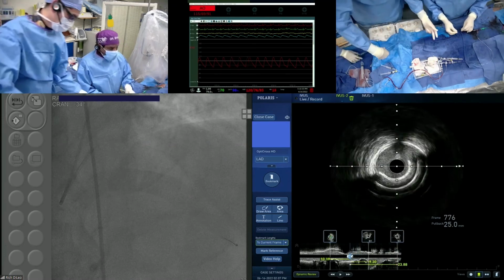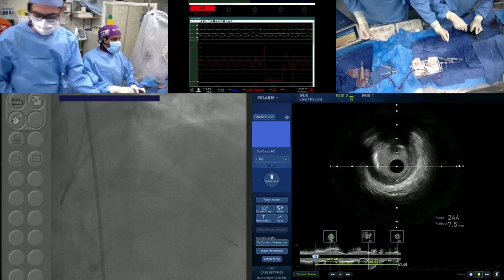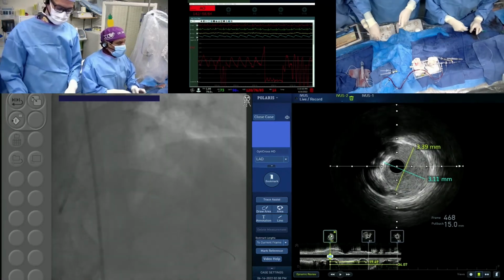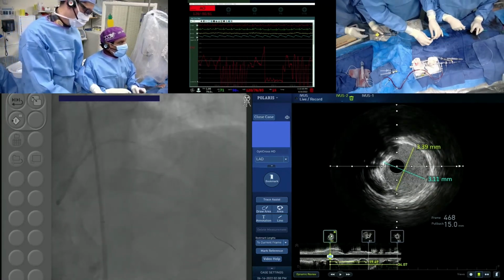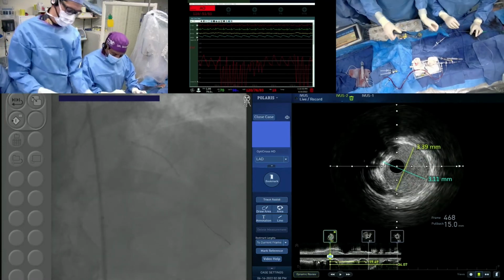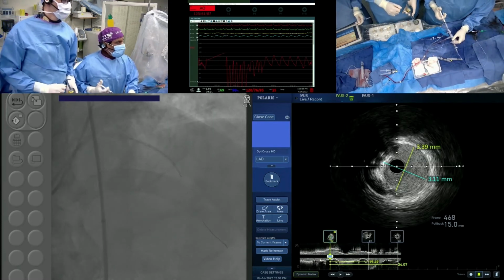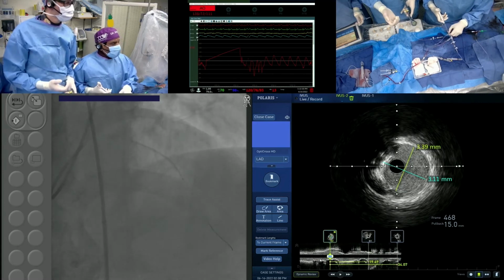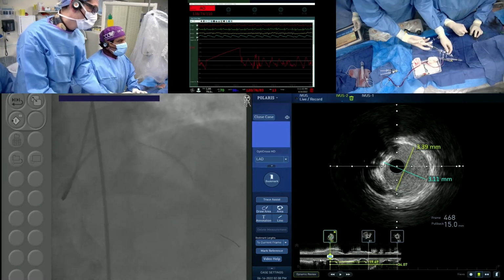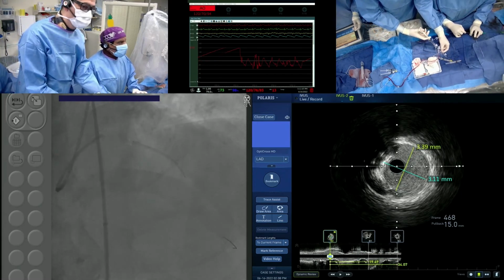Absolutely. You are absolutely correct. The question is at what point you bring IVL in this particular case. That's a very good point. I would say two things. If I had not done the imaging, or if imaging says the lumen is looking good, we have made some cuts, some interruption, it's okay, and it's not a deep calcium which we have modified. Or secondly, if you have done the ROTA, you go to a high pressure balloon or cutting balloon, a little dilatation.